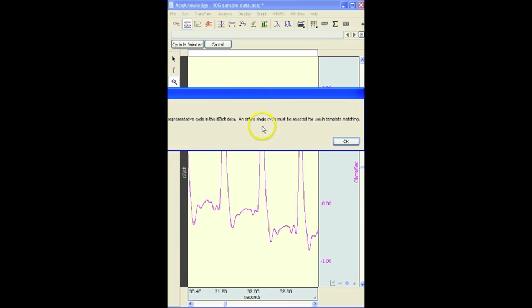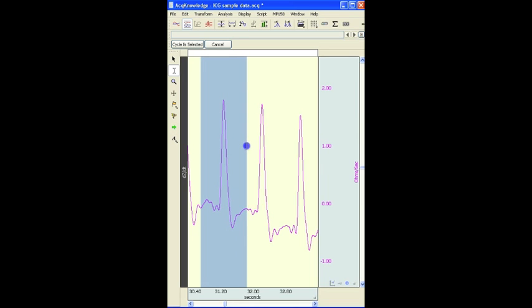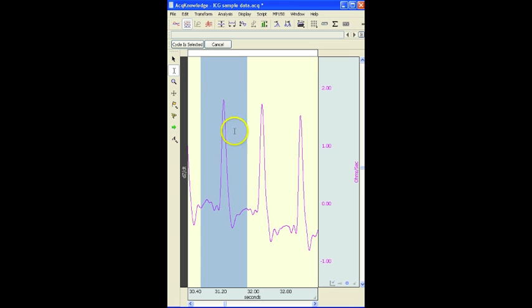An entire single cycle has to be selected in order to use the template matching method. There are a number of methods for detecting the individual DZDT cycles. The default one is using an adaptive template method. We'll get to those options in a little while. So here I've highlighted one complete waveform.